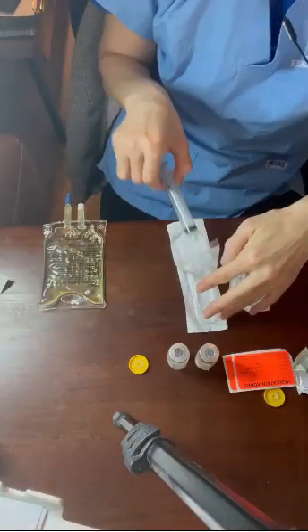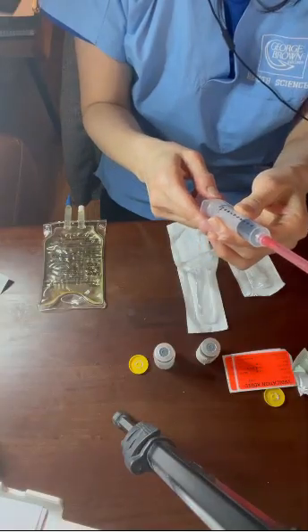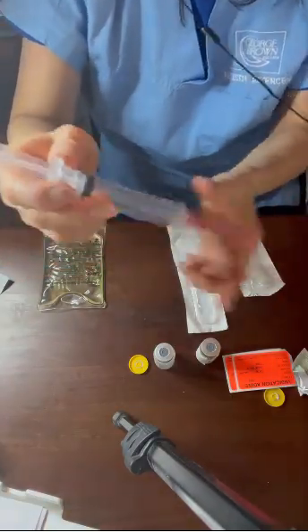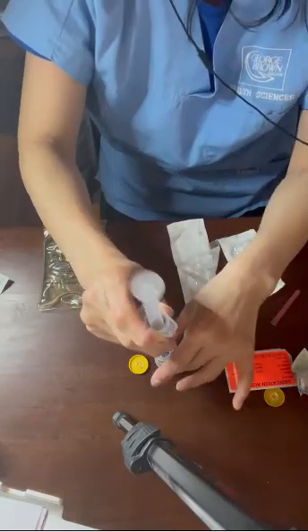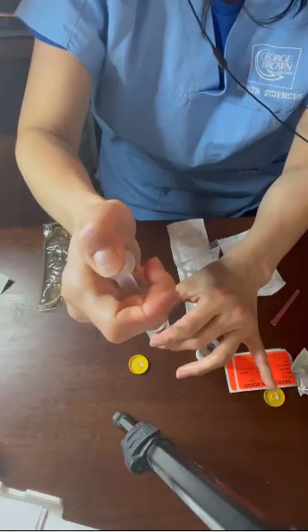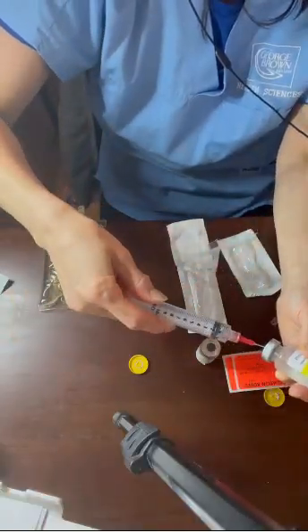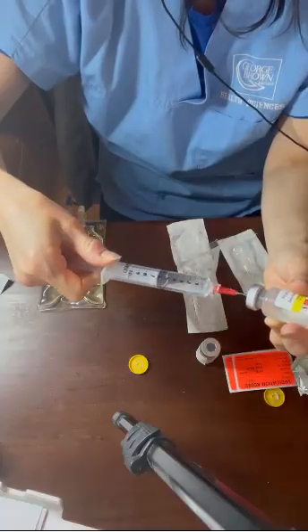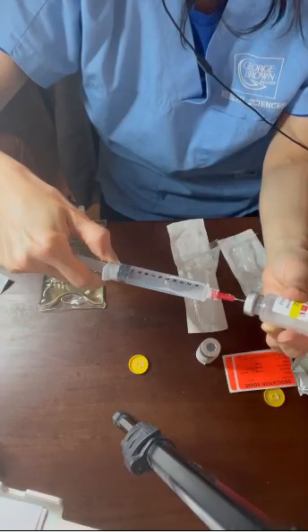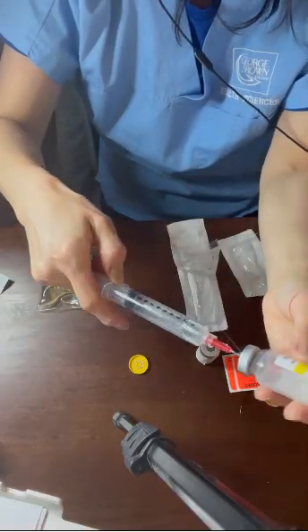Now I'm going to assemble these two, to draw 10 milliliters of the normal saline and aspirate in the saline vial. And I'm going to draw them. Okay.